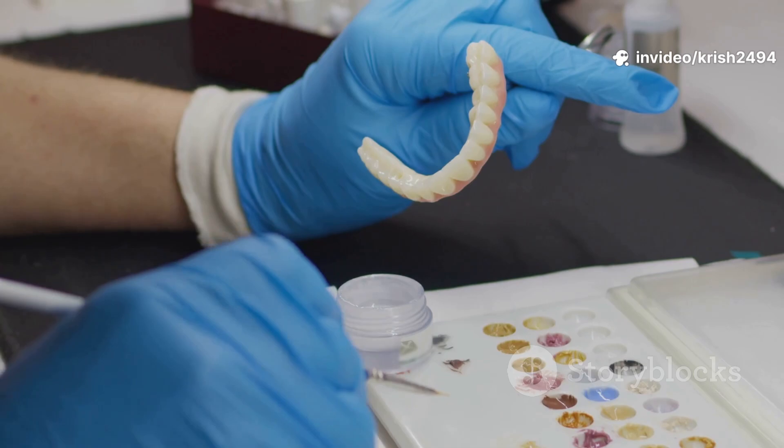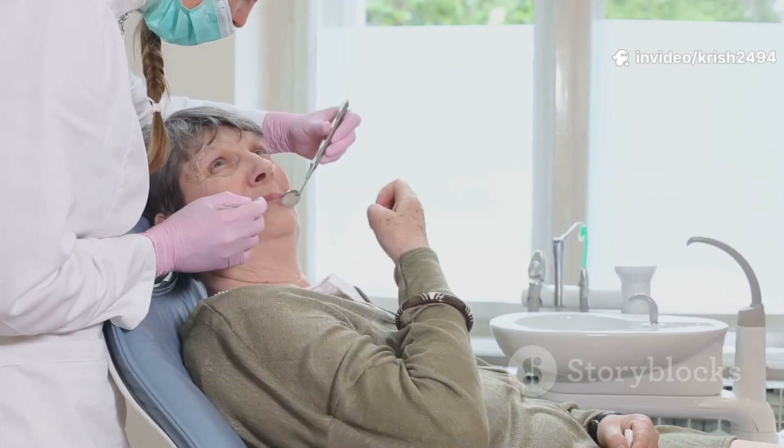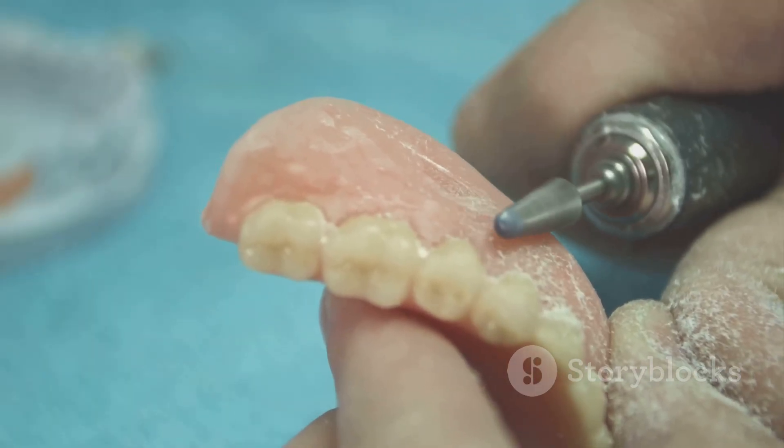At the try-in appointment, you get to test drive your new smile. The dentist pops the wax trial dentures in your mouth, checks your smile, speech, and bite, and makes tweaks until everything looks and feels right.